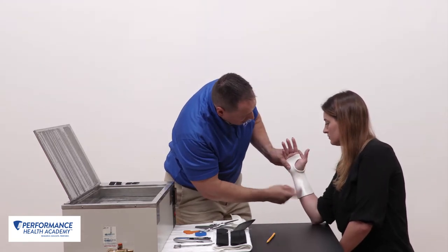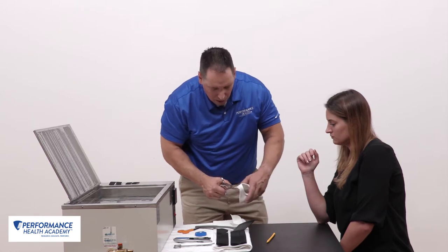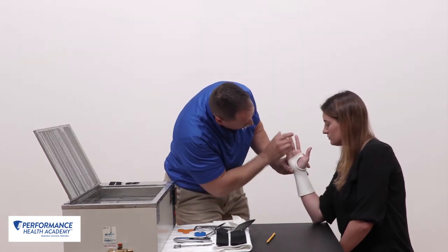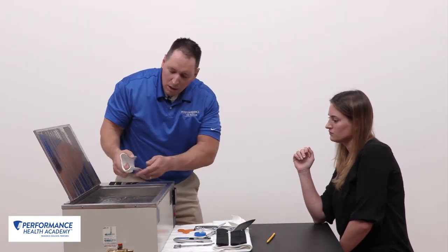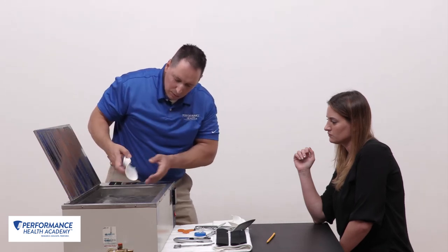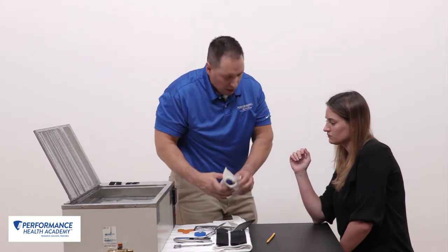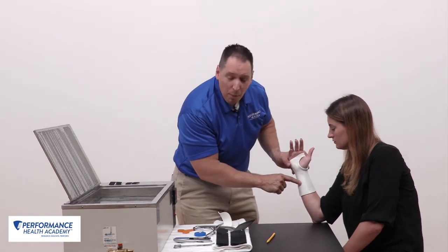I'll reapply. I have an appropriate fit — borders are good. I'll take down my distal palmar crease. She's able to flex okay; the MCPs aren't impeded. Now I'll smooth off my edges just as done before. This material edges very well. I take away any hard edges or sharp points that may cause skin maceration and breakdown. I wipe the orthosis down and now I'm ready to apply my strapping.